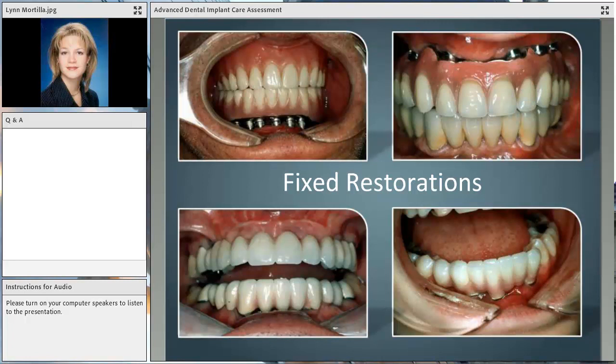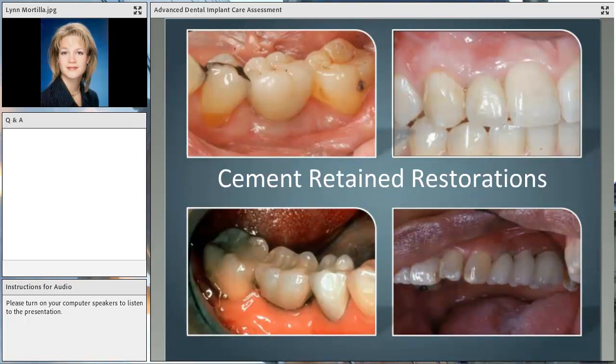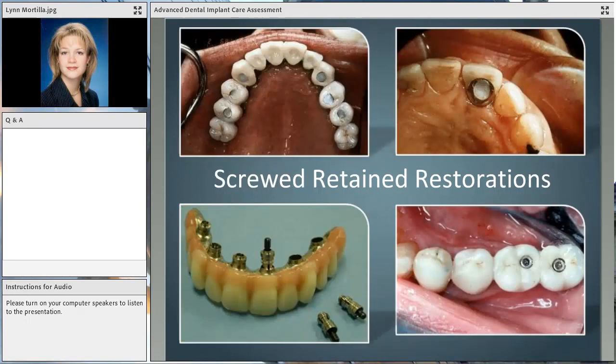Anytime you have something that's all connected this way, the oral hygiene care that the patient can provide becomes very, very crucially important. Cement retained restorations that aren't bound together, that work as single teeth, you floss them like single teeth. Unfortunately, if we bind those bridges together, we're looking towards a floss threader to use for cases like that. People would treatment plan that type of restoration if they needed more support, or they were challenged in terms of the patient's load that had to be applied to these areas. So all of those things go into that type of treatment planning.